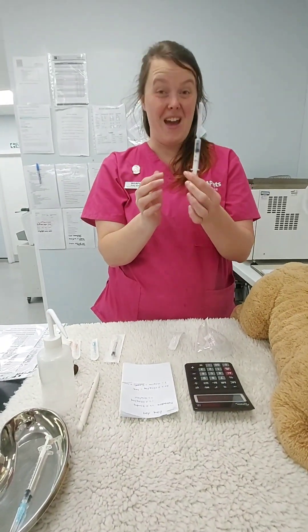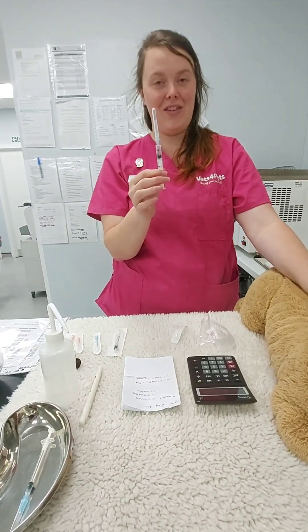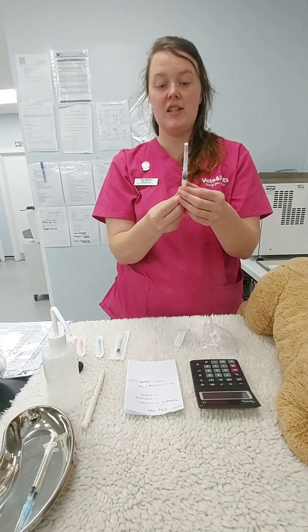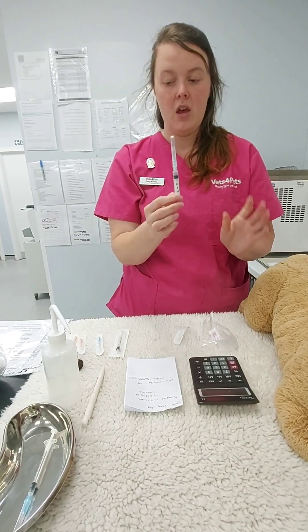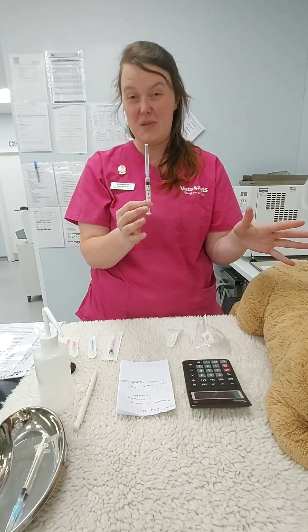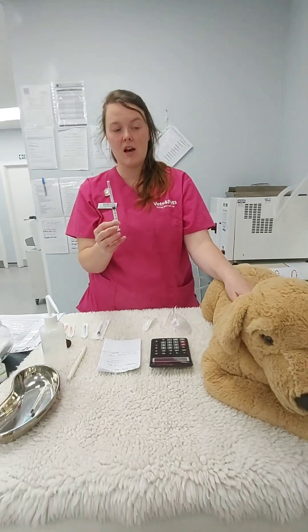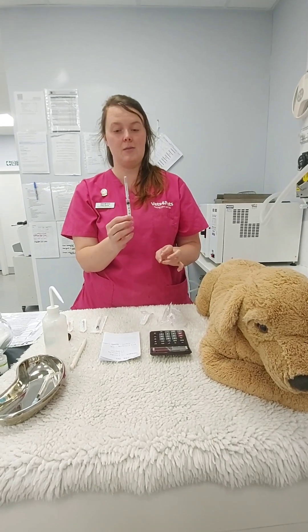The examiner will then provide you with an empty syringe with air in it — don't panic, there's nothing in there. Obviously if 50-odd students were doing the exam with water, you'd end up with a very soggy patient, so they give you a syringe full of air, usually between 0.5 ml and 1 ml. Next step is to make sure you have an assistant to hold your patient — ask your examiner to restrain the patient.